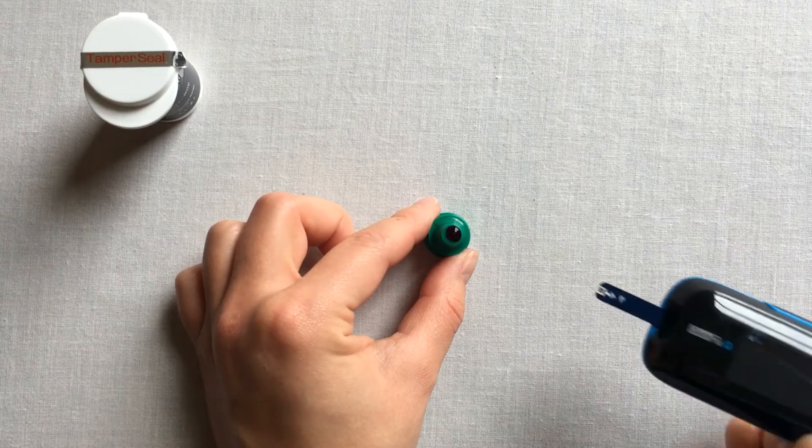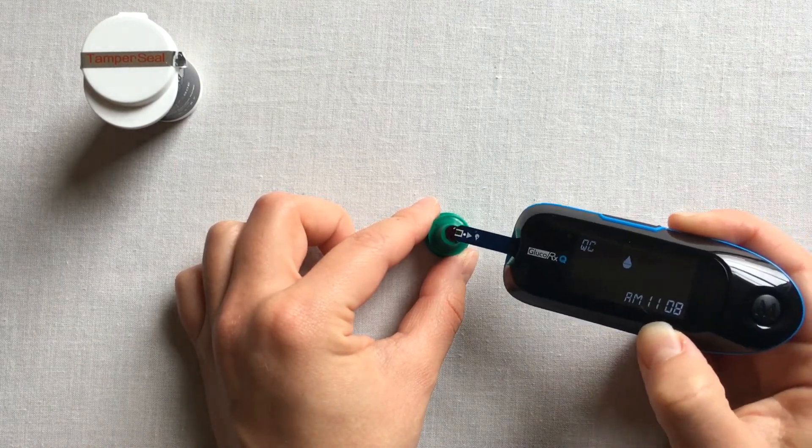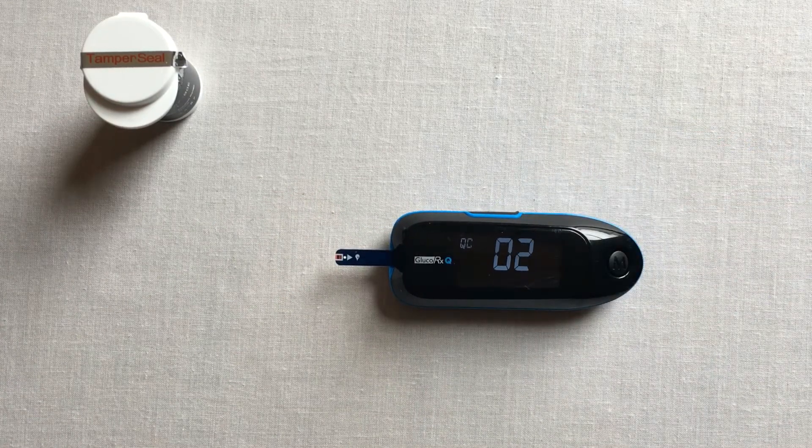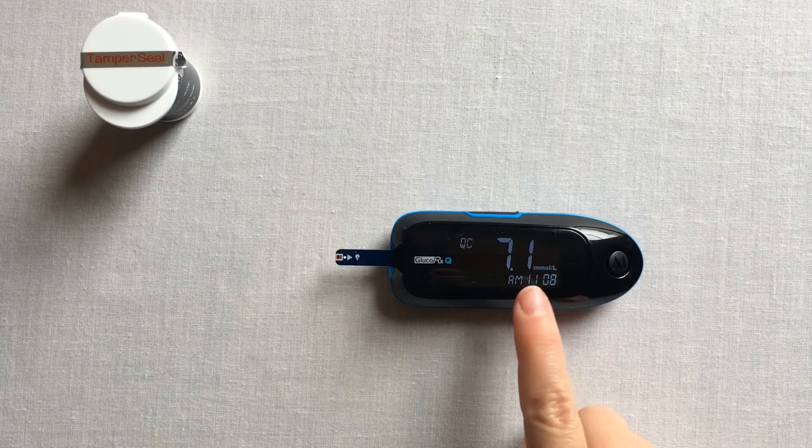Hold the meter and move your test strip to touch the solution droplet. The meter will automatically begin to count down from 6 to 0. Your control solution result will then appear on the screen.